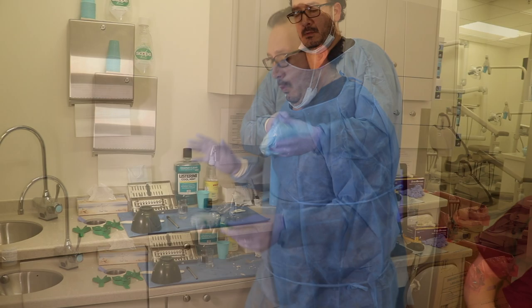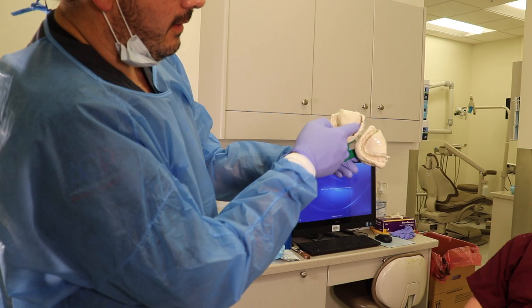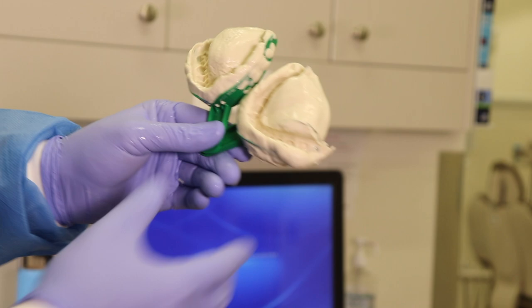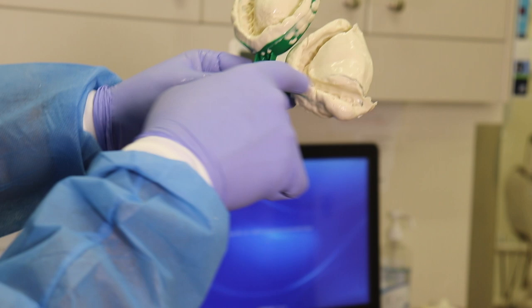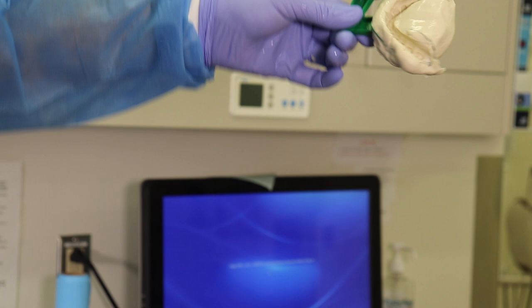Once we got the two impressions, this is what I want to get out of the impressions. Like I said, all the teeth are enclosed within the limits of the tray. I have copied the deepest portion of the vestibule. On the tongue space of the lower, I filled it up with some extra alginate, and these alginate impressions are ready to be poured. We'll go upstairs and pour them up in the lab.